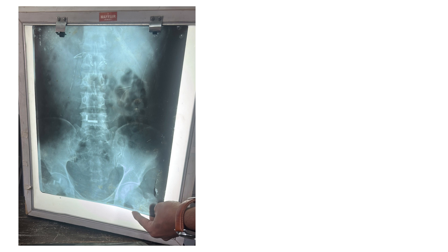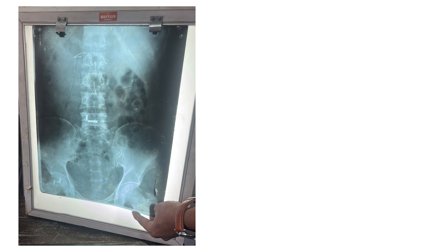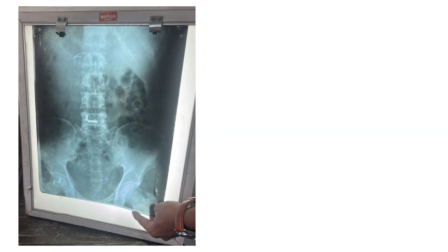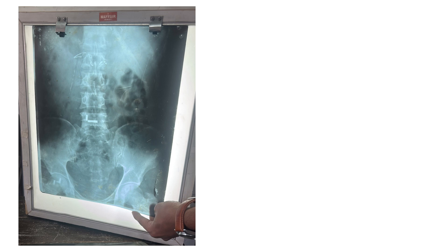The soft tissue shadows that are visible are that of the diaphragm, the psoas major muscle, the kidney, the liver, and the spleen. The gas in the fundus of the stomach may be seen as a large bubble, which appears as a dark shadow. Intestinal gas may also be seen. This X-ray may be used to check for any sort of intestinal obstruction.